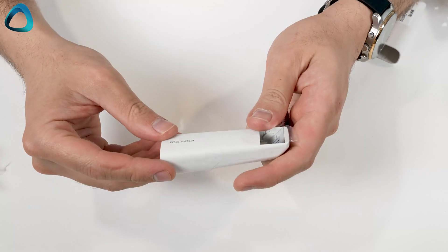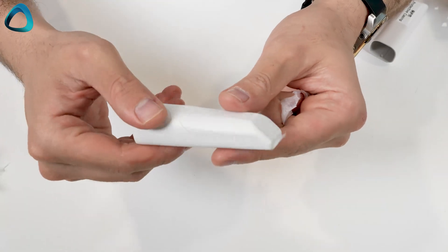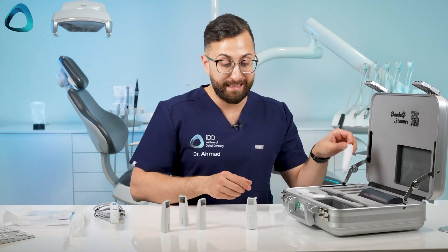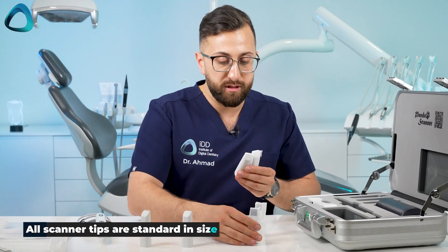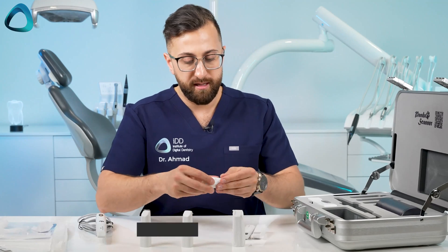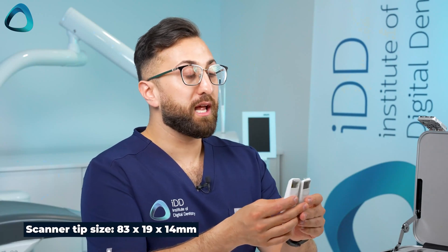We also have scanner tips, and the company gives you six scanner tips here, which is quite an incredible number given the price of the scanner. Having a quick look at them, they do look like they are all the same size — there isn't an adult size and child size. They all look like they are the same size. So you've got six scanner tips right here with the scanner.